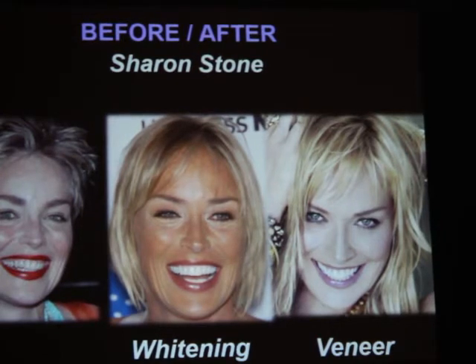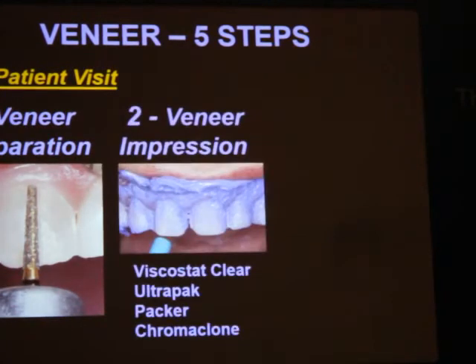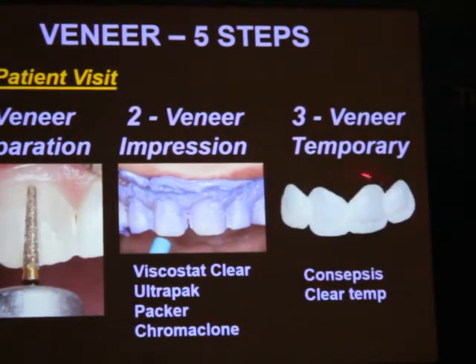Okay. So now we will see the different steps to prepare the veneer. Basically, you have two visits. The first visit, you will prepare your veneer, you will do your impression, and you will make your temporary veneer.